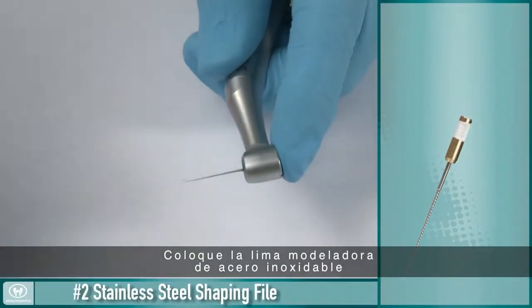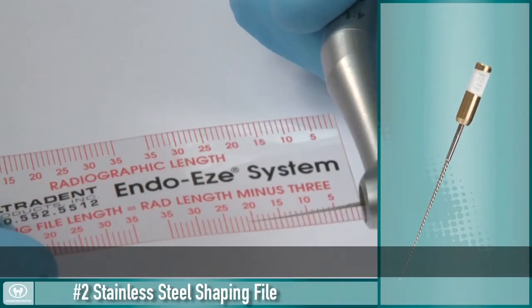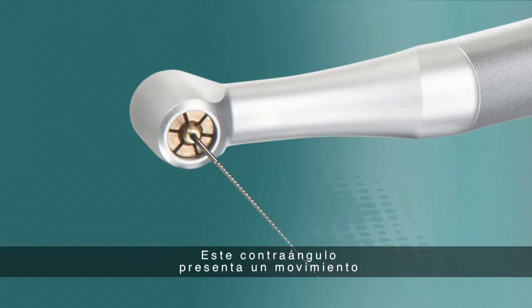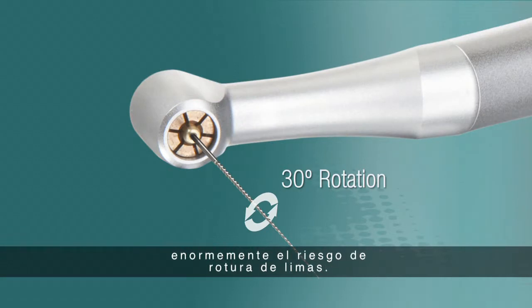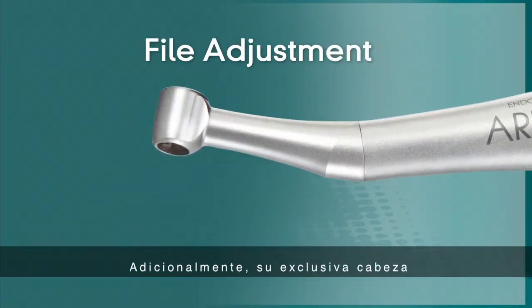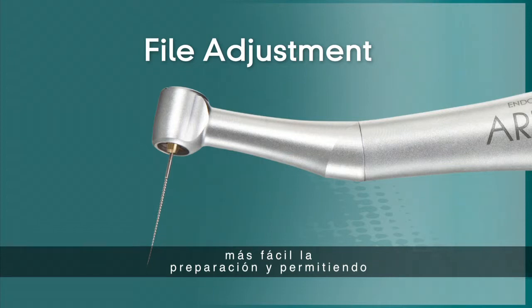Place the number 2 stainless steel shaping file into the Endo-EZE AET contraangle and set it to the working length using the adjustable head and endo ruler. This contraangle features a 30-degree reciprocating motion that allows instruments to follow the natural anatomy of the canal wall while greatly reducing the risk of file separation.